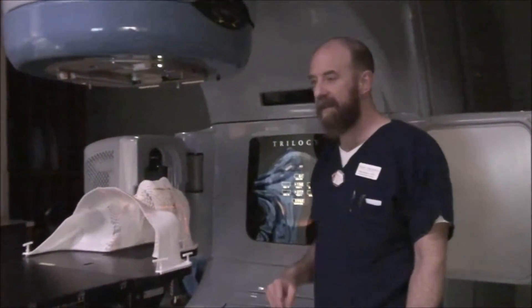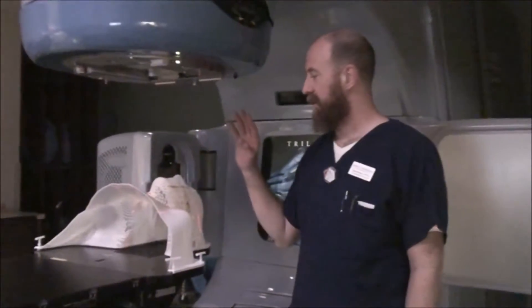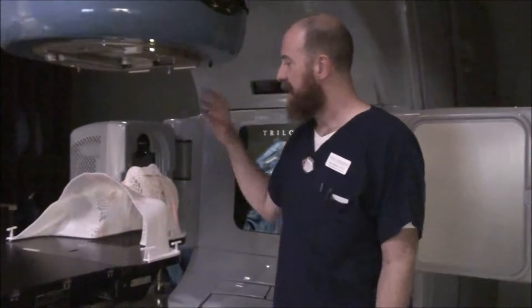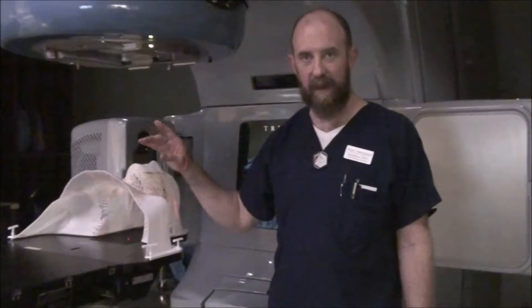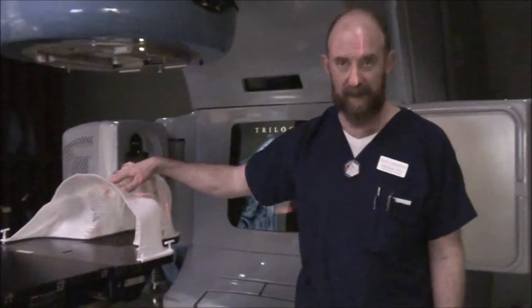The last thing you want to do: you're going to go out of the room, you're going to fluoro, and the doctor's going to okay it. When she says it's okay, you go ahead and come back in the room after documenting everything, including the vertical, because you're not going to move this again. You've already simulated this — we can actually go ahead and film it.